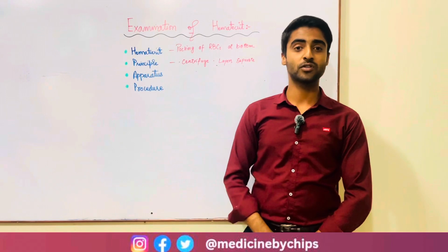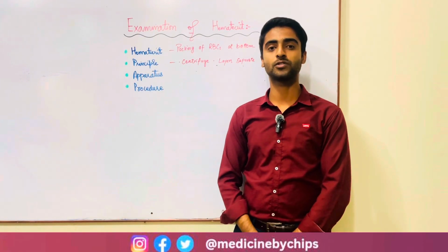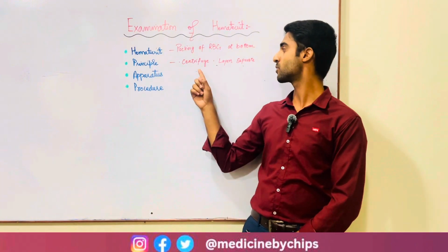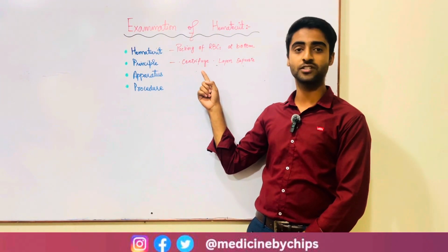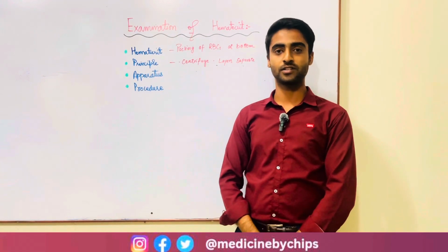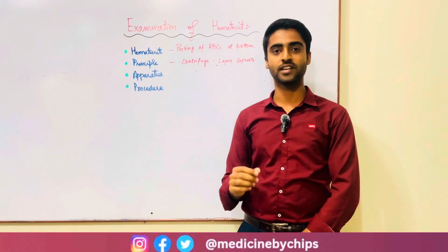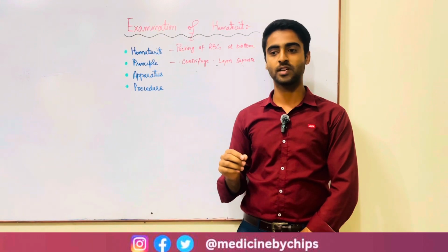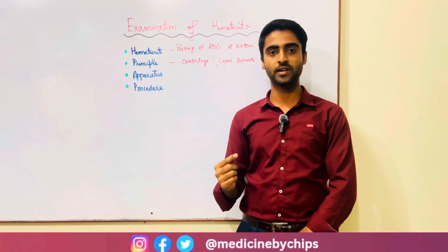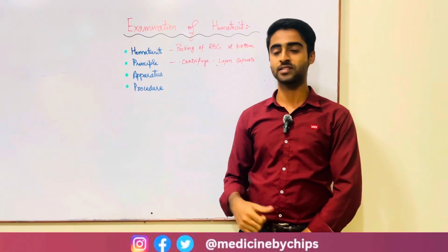Now, if you talk about the experiment, first of all, we should know the principle of this procedure. The principle is divided into two parts. First is centrifugation and the separation of the layers. For centrifugation, a sample of the blood is taken in a tube and the tube is placed in a centrifuge machine. The centrifugal forces separate the layers of the blood.